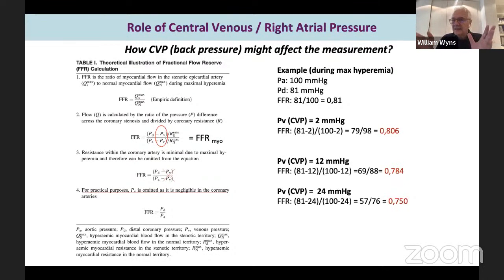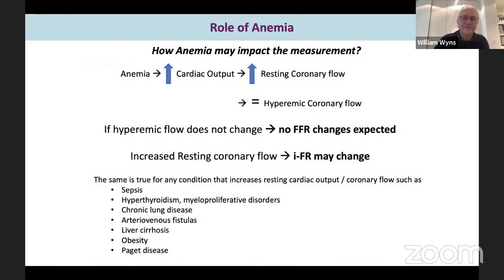So if you have a patient like that with a lesion where you wonder whether it's significant, keep the story of the right atrial pressure in mind. But by and large, in a pragmatic way, in the vast majority of patients you're studying, it's not gonna matter. I hope I made that point clear. So here again, a very high increase in right atrial pressure, or back pressure to the flow, reduces the FFR myocardial. That was the definition when you incorporate right atrial pressure. Well, if you just measure the two pressures, you will miss that point.